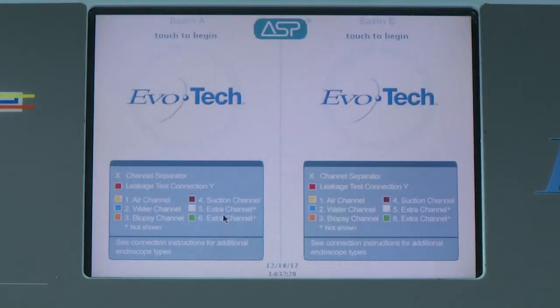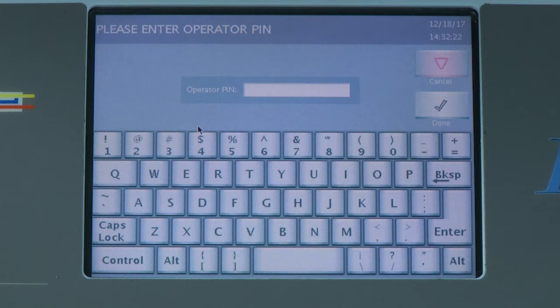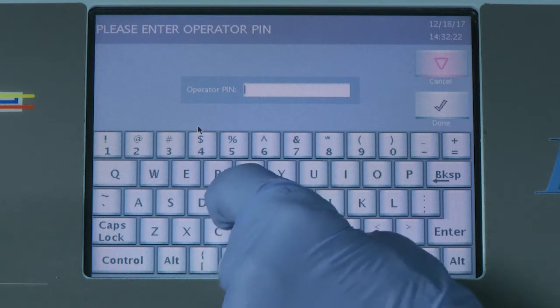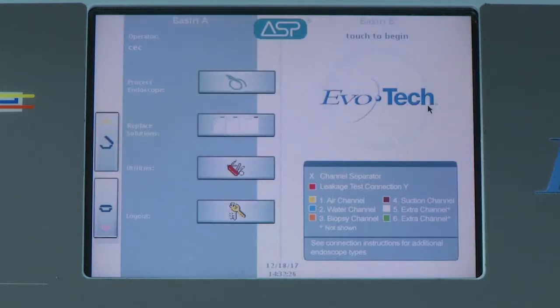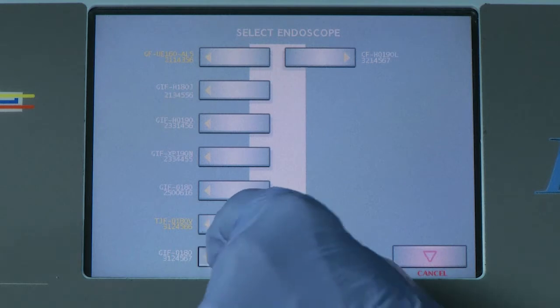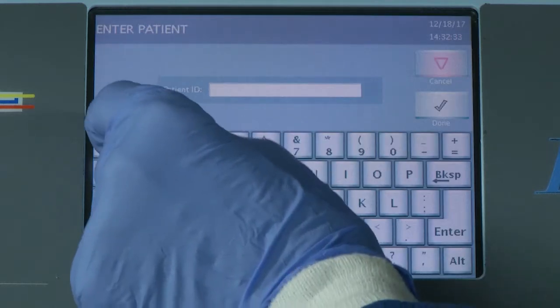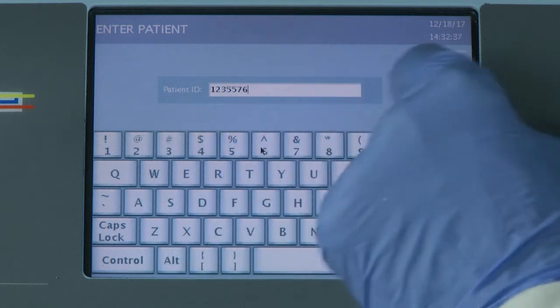To start a cycle, touch the side of the startup control panel in which your scope has been placed, Basin A or B. If your facility has opted to require operator identification, you will enter your user PIN. Select the endoscope ID from the drop-down scope list. Select Patient ID and enter the patient information, if applicable, for your department.